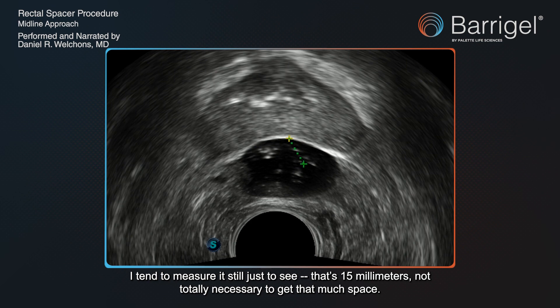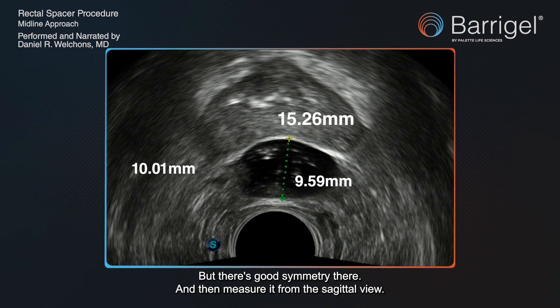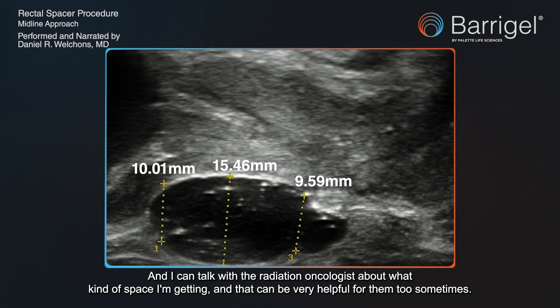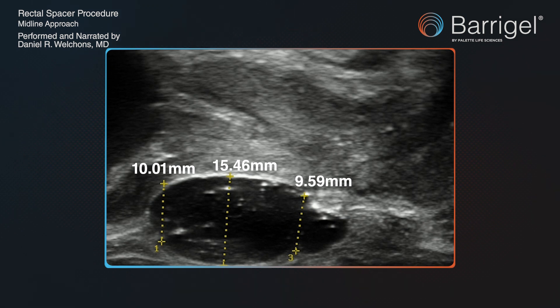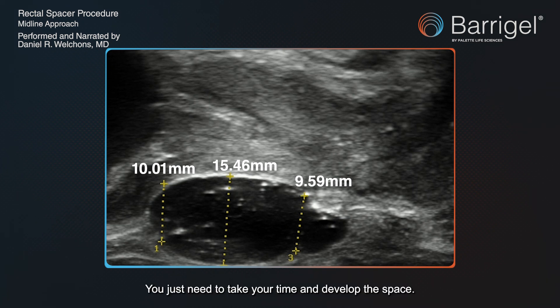Now we measure it. I tend to measure it just to see — that's 15 millimeters. It's not totally necessary to get that much space, but there's good symmetry there. Then measure it from the sagittal view. I can talk with the radiation oncologist about what kind of space I'm getting, and that can be very helpful for them too. The procedure is easy to control — you know where you're going the entire time. You just need to take your time and develop the space.